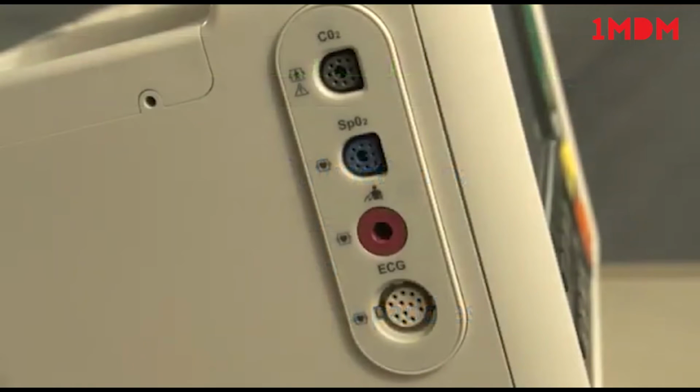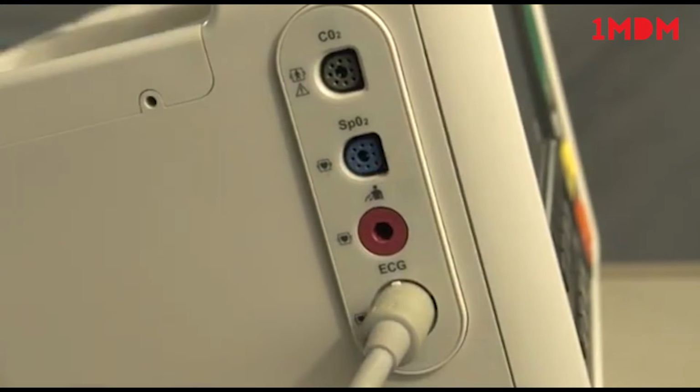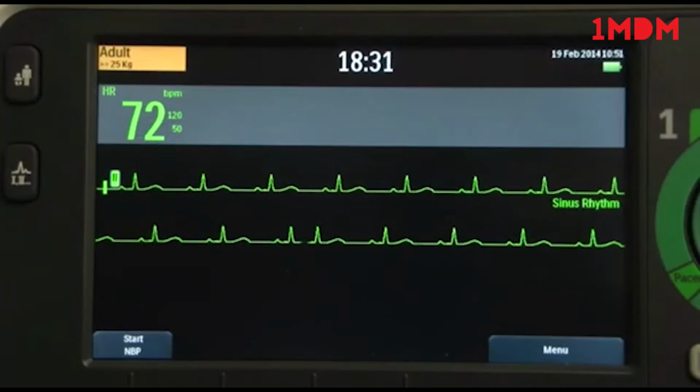The ECG cable is color-coded and keyed to fit the white ECG port. For proper lead placement in 3 and 5 lead sets, consult the instructions for use. The monitoring leads available depend on what type of ECG cable is connected to the DFM100.